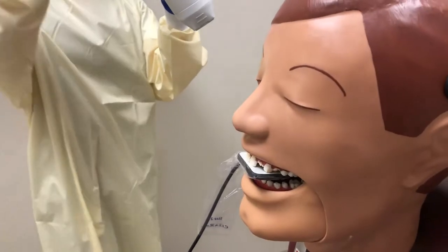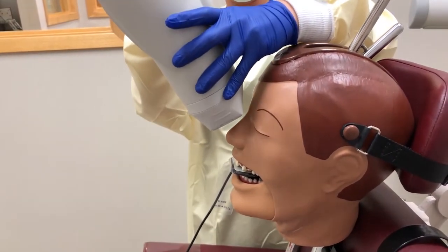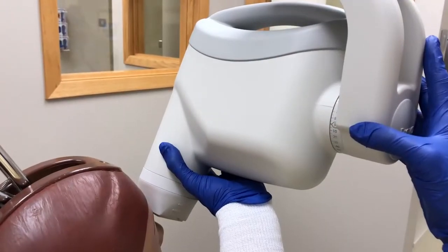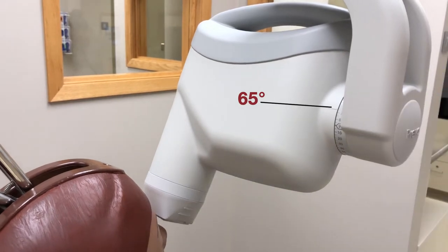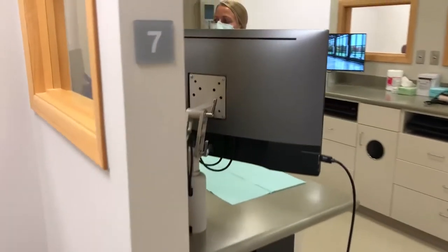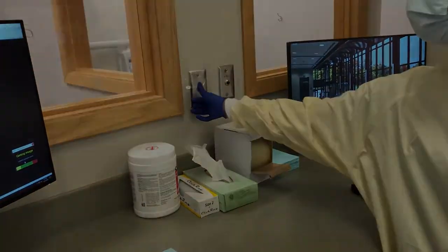The University of Nebraska Medical Center College of Dentistry used to use the phosphor plate method; however, digital sensors are the only system currently used in the college. When the digital sensor is positioned, instruct the patient to gently bite down to hold the sensor in an end-to-end bite. Next, position the position-indicating device so that the central ray is directed through the midline of the arch toward the center of the sensor. The position-indicating device should be at about a 65-degree angle, positioned between the patient's eyebrows on the bridge of the nose.